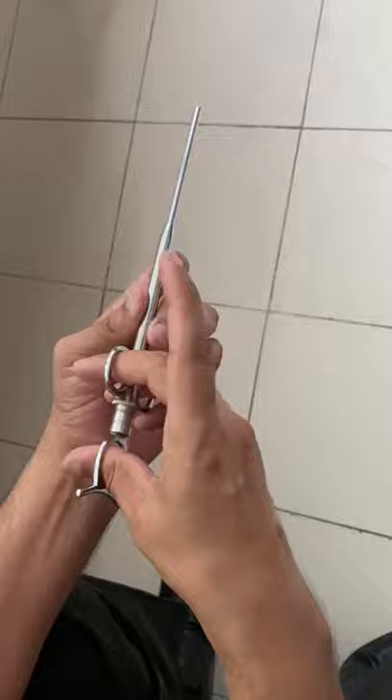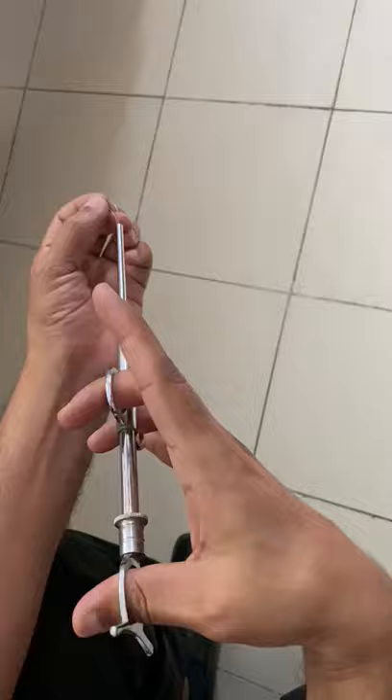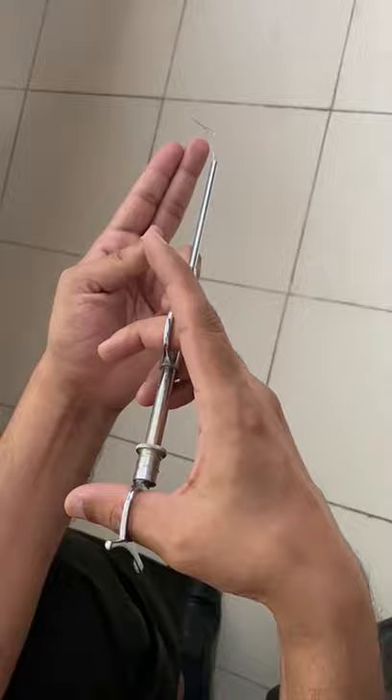This will ensure that the clotting is very good for you. You have to squeeze it, so that it will ensure easy clotting in the process, so that there won't be bleeding. If we cut with the scissors, it may not ensure this.